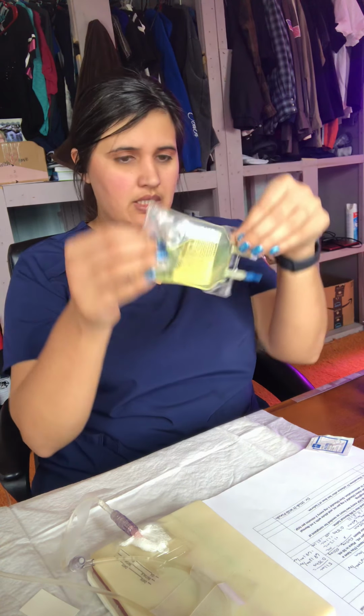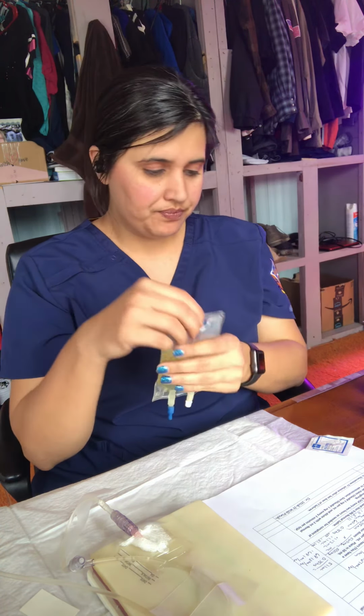I will take and invert the bag a few times. Make sure the medication is mixed. It's yellow now. Okay, that's done. It's inverted. I will take my Piggyback tubing and get it out. Piggyback tubing out.